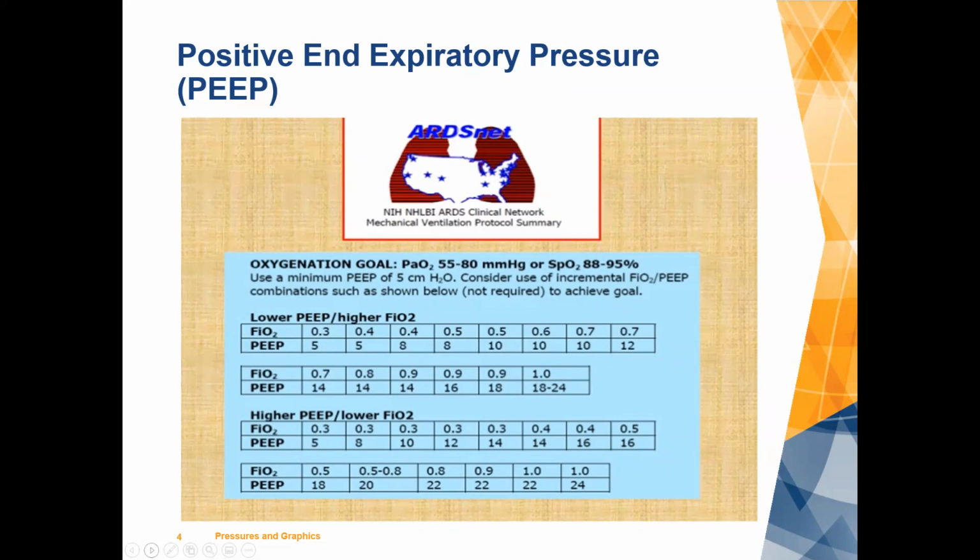The significance is not just tidal volumes, but the subsequent work that's been done related to ARDSNet. Okay, so really reducing the chance of us harming a patient who's receiving mechanical ventilation because they're on mechanical ventilation. So in addition to using lower tidal volumes, the recommendations are more liberal use of PEEP, more liberal use of PEEP.